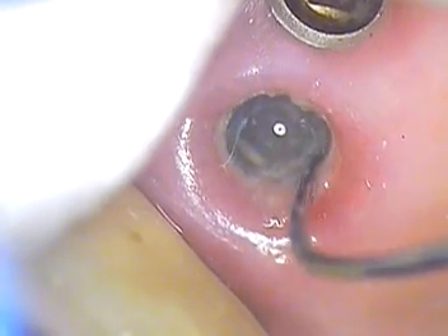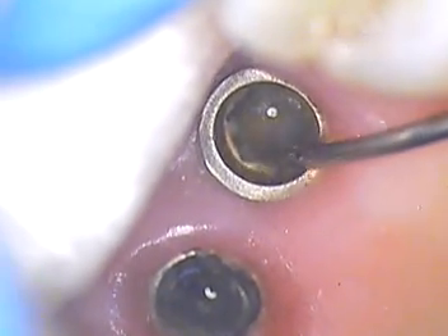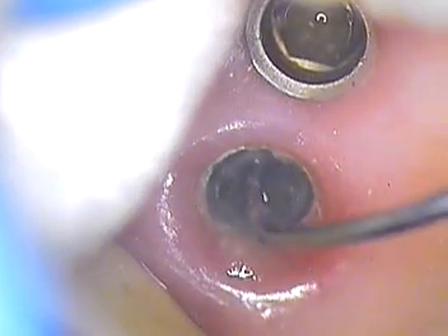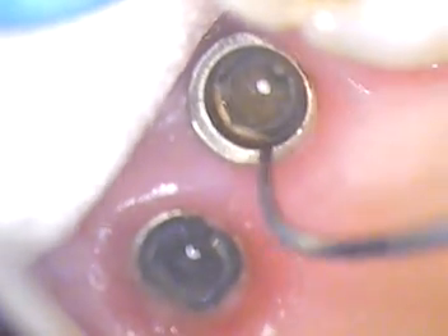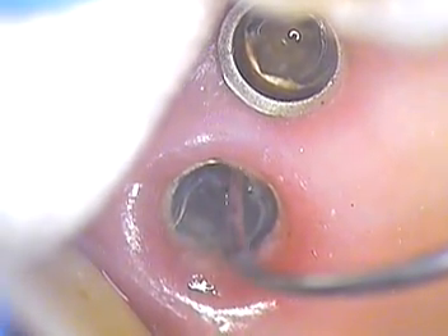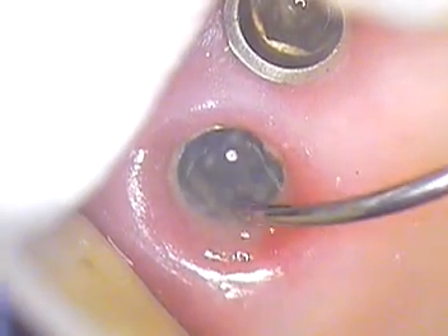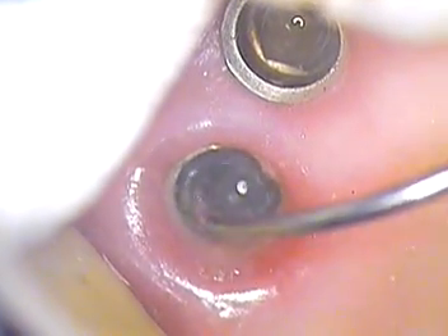Once we do that, the next steps are to follow. We have to do a try-in. I've still got my work cut out for me with the screws inside the case. After I get the screws cleaned up on the two-unit splint, I'll put it in a cement remover. If we can get the cement to let go between the crowns and the abutments, then that's even better. We'll have total control of the screws — change them out, get them cleaned up, and work in that direction.